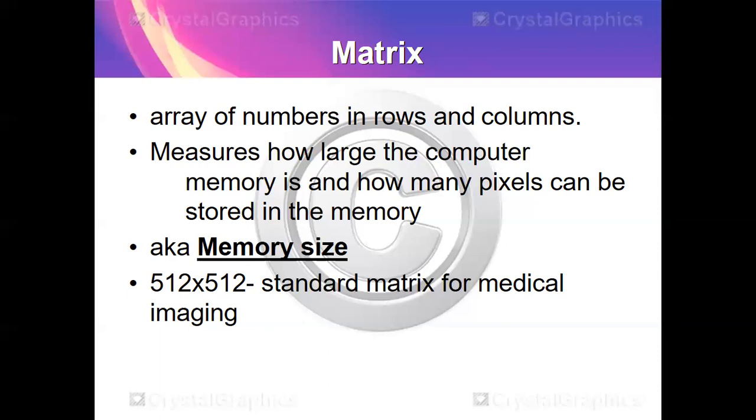So matrix is also termed as the memory size, and the standard matrix used in medical imaging has a memory size of 512 by 512.